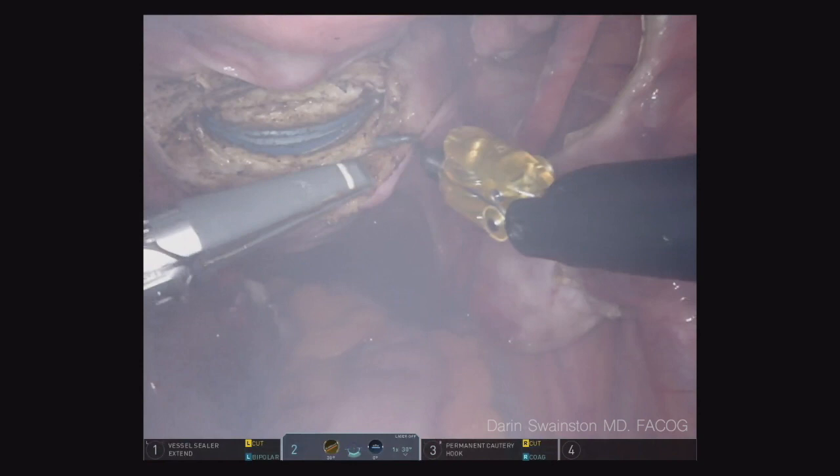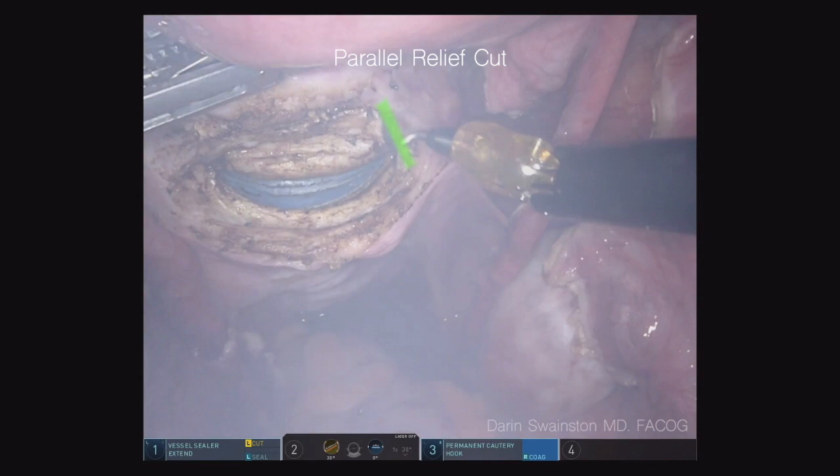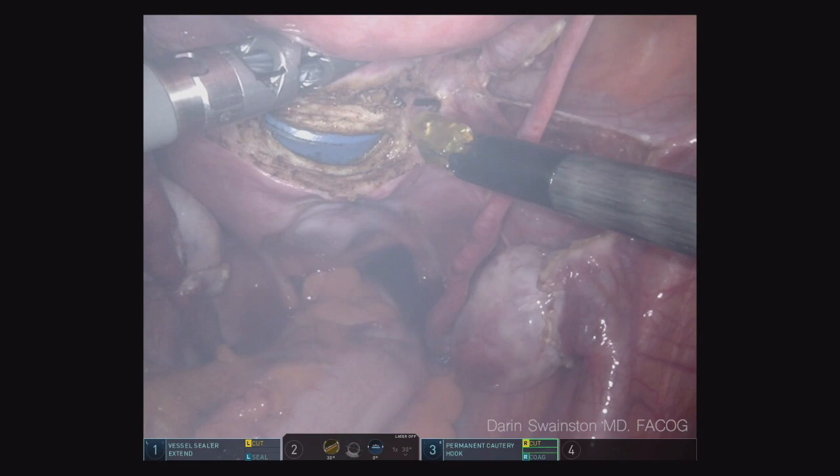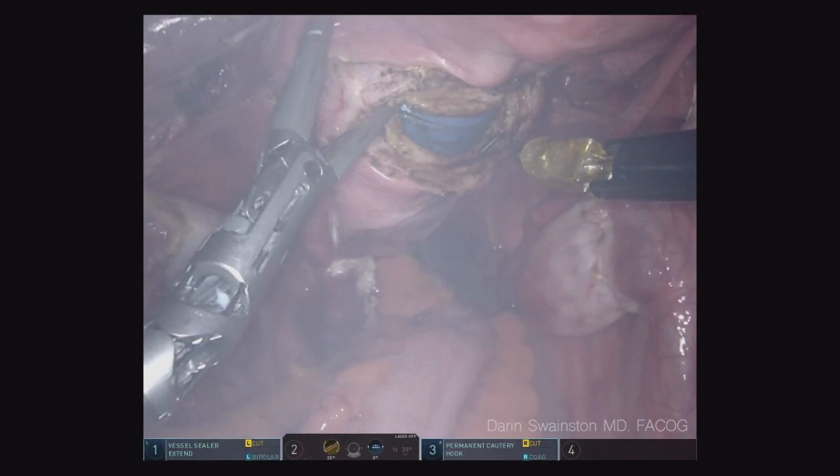Then I do this parallel relief cut underneath the vessel so I can just slide the vessel sealer extend right up around the vessel. You're not going into the vaginal mucosa — you're just sliding it up around the vessel. It's a super efficient way of taking vessels. The next step would be to go ahead and do the other side. If you do it correctly, it works very well — you shouldn't have to force it. It should just slip right in.